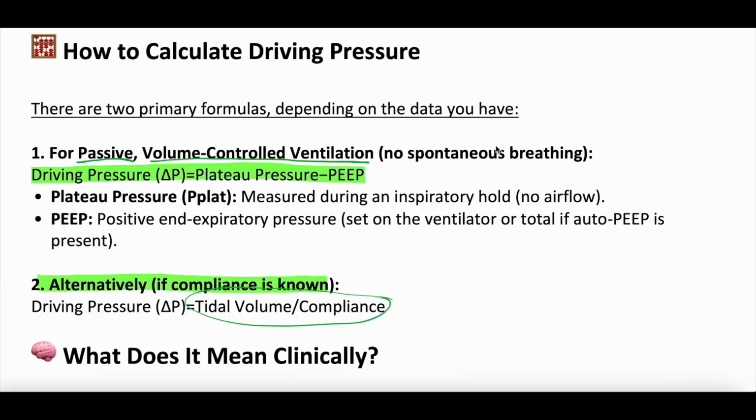And what you have to do is get a plateau pressure. If you do not know what a plateau pressure is, this video is probably a little beyond where you're at. We have a whole playlist on all things mechanical ventilation where we dive into plateau pressure. It's linked in this episode's description, so definitely check that out and then return to this. For those of you who do know what a plateau pressure is, friendly little reminder, you have to get a plateau pressure with an inspiratory hold.